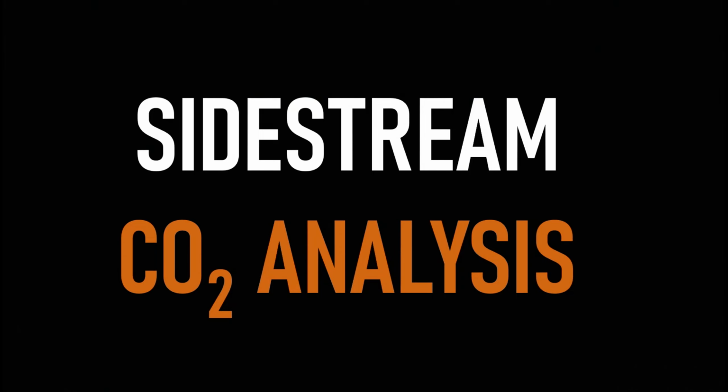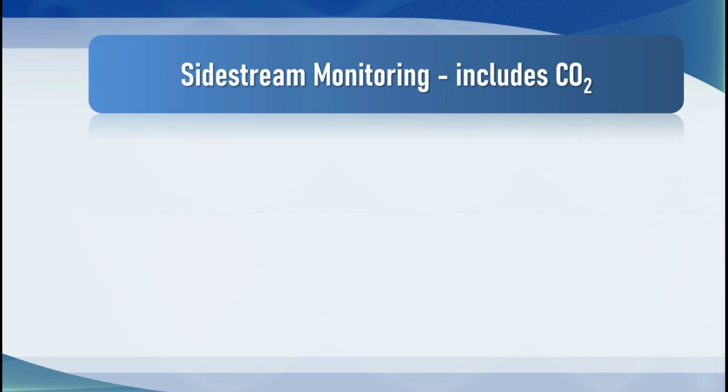Let's start the discussion with sidestream CO2 analysis. We previously discussed mainstream CO2 analyzers, which are terrific in intubated patients and provide instantaneous information, but add significant weight near the endotracheal tube. So they're not great in the ICU, they're not great in prone or other awkward positions, and can only be used with invasive airway devices and don't measure other airway gases.